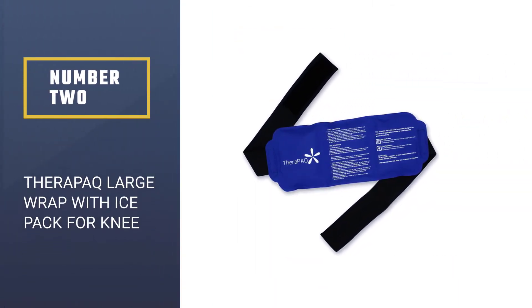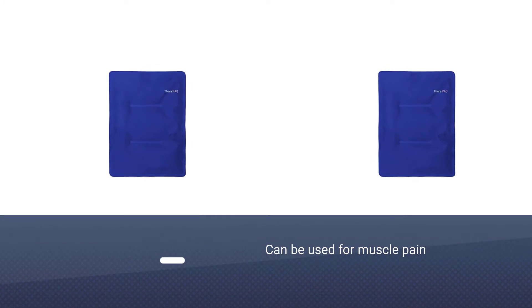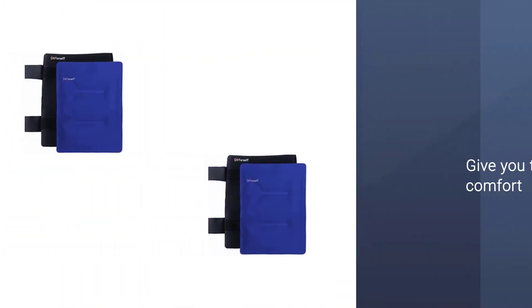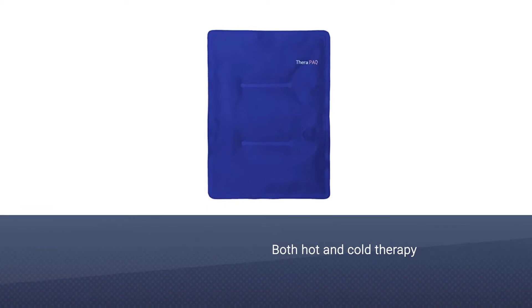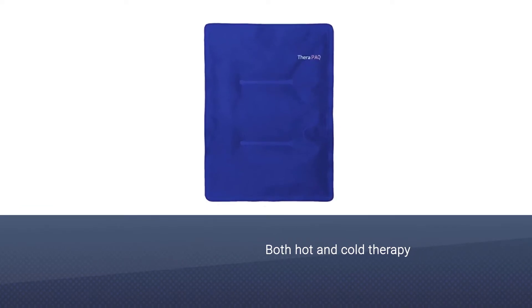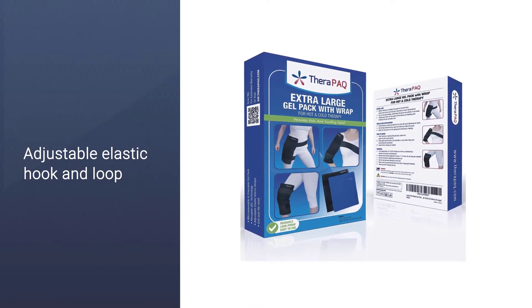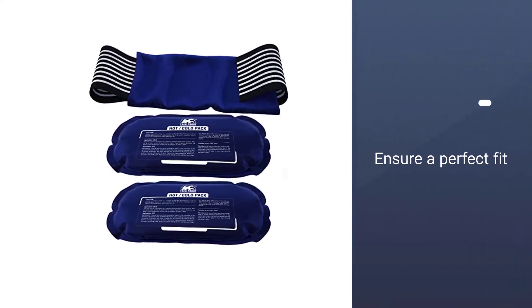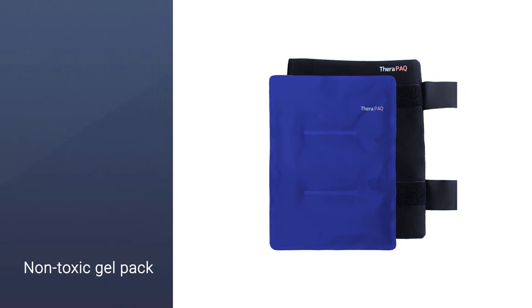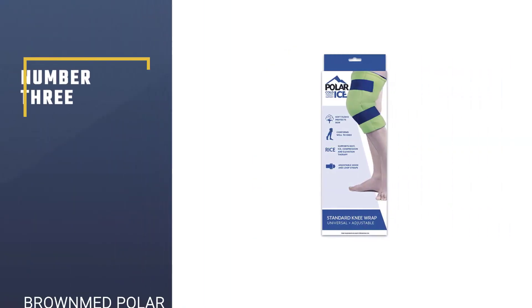Number two: Therapy AQ Large Wrap with Ice Pack for Knee. This product can be used for muscle pain, post-surgery, arthritis, or any other injury. It provides both hot and cold therapy, keeping you relaxed and comfortable. With adjustable elastic hook and loop straps, it ensures a perfect fit on the shoulder, knee, ankle, thigh, and upper arm. The gel pack is made of non-toxic materials; the plastic is leak-proof and flexible.